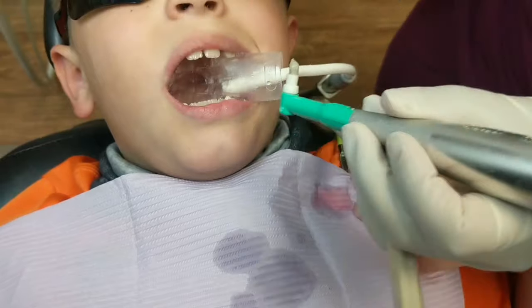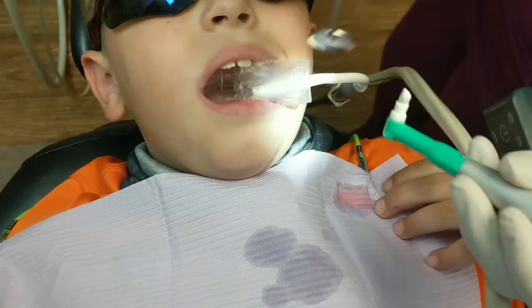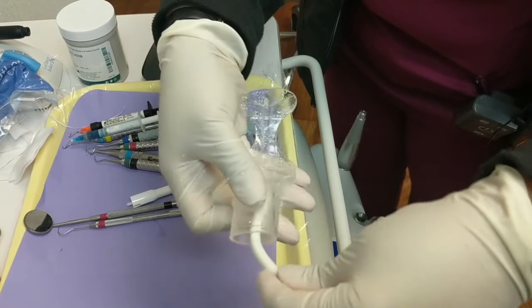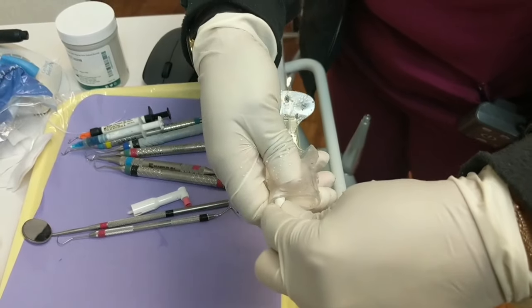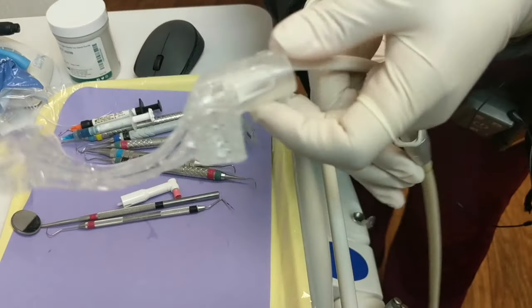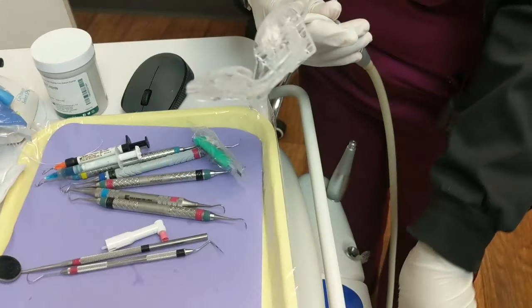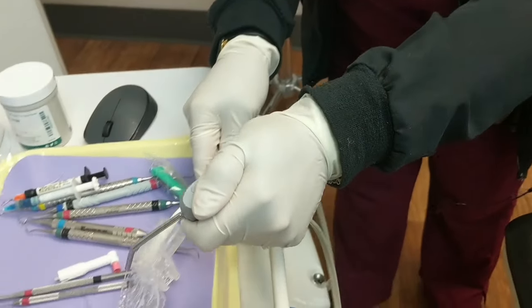All right, so on my young patients, in the video you'll see me polishing with the pumice, and I did this actually before I cleaned their teeth. First things first, I got my pumice ready, got my tapered prophy head, and started polishing the teeth that I knew I was going to seal. Once I got that cleaned off, I used my Isolite and had my suction put in there, and wet it around a little bit to make it a little more comfortable for him.